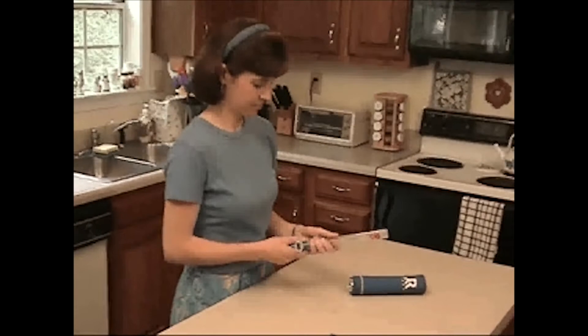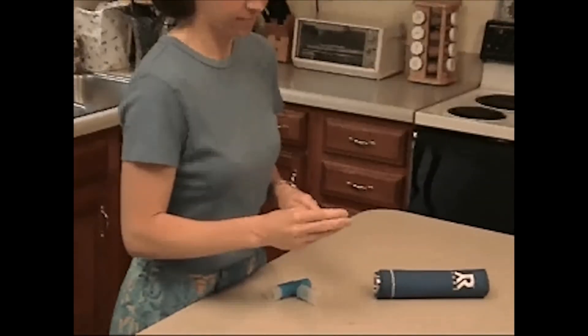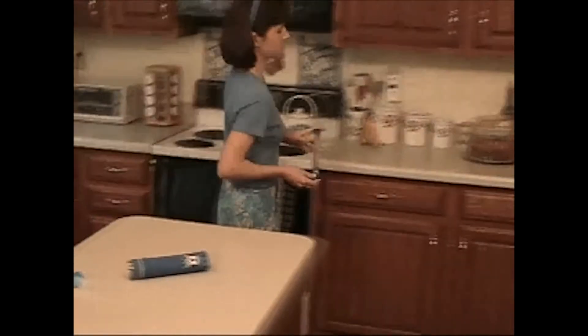After breathing for a predetermined period of time, caps are placed over the ends of the R tube. Her name and date can be recorded on the label, and the R tube is stored in the freezer.